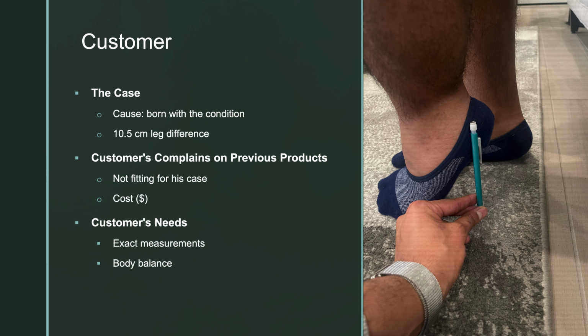And I want to talk about how we met our client. He's actually a friend of mine, and we thought it would be a great opportunity to help someone that we personally know. First, according to the customer, he was born with his condition. It wasn't caused by any accidents, and the difference between his legs is 10.5 centimeters.